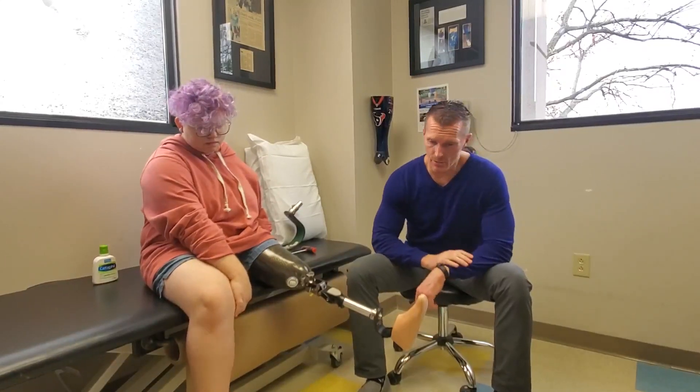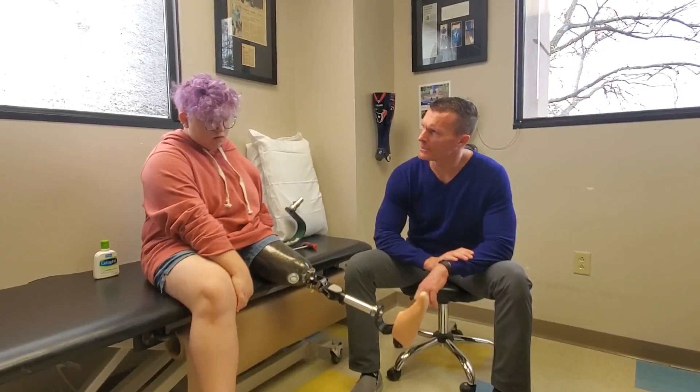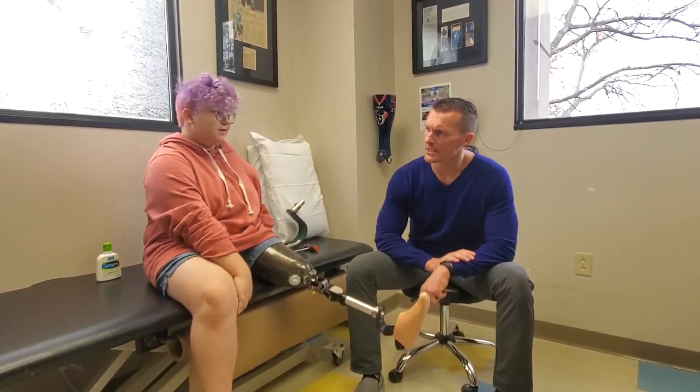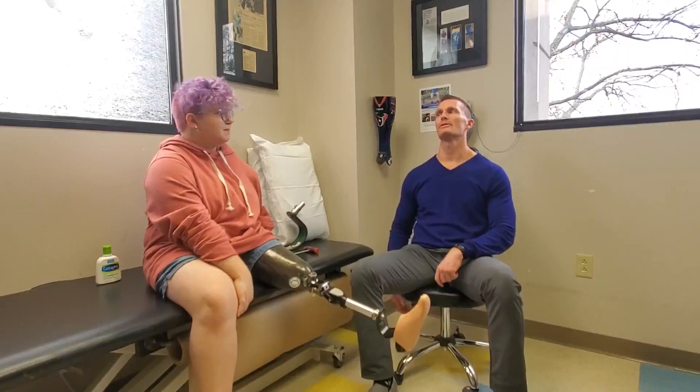I don't know how many — you went into the first socket. How long did you get out of the very first socket? It was a while, wasn't it? I think it was about a year or two-ish. I think it was about two years. Because you kind of tough it out with stuff too, a little longer.